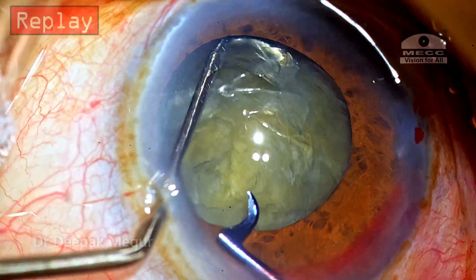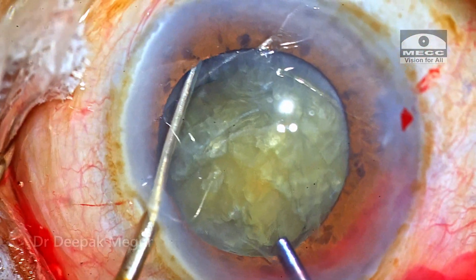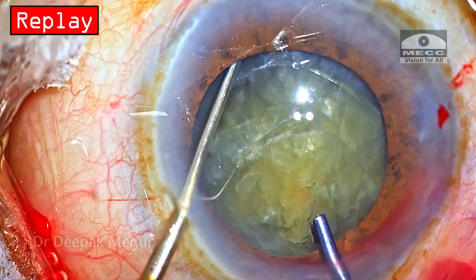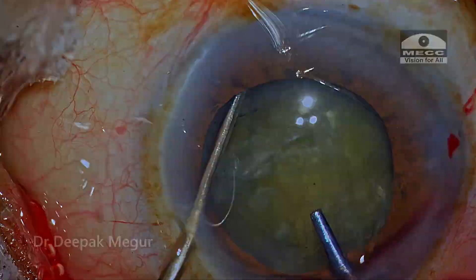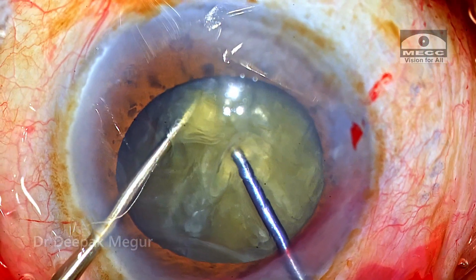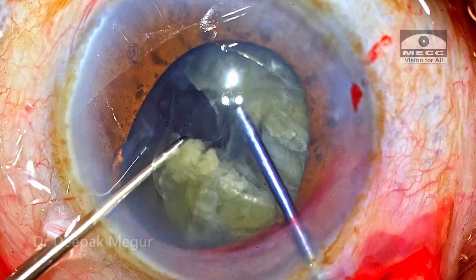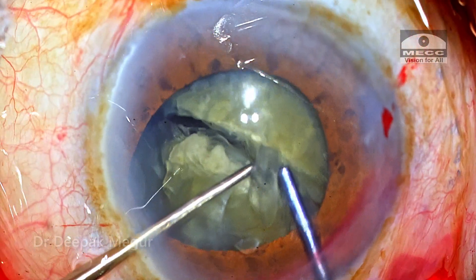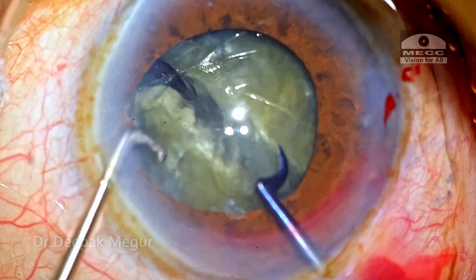This is a grade 3 nucleus in an elderly man and hence I expect it to be reasonably dense. So appropriate hooking of the endonucleus at the distal end by the Chang chopper and reasonably deep placement of the pre-chopper is ensured before moving these two instruments towards each other. As the two instruments approach each other, the nucleus cracks into two halves. These two instruments themselves are used to perform lateral separation of the hemi nucleus.